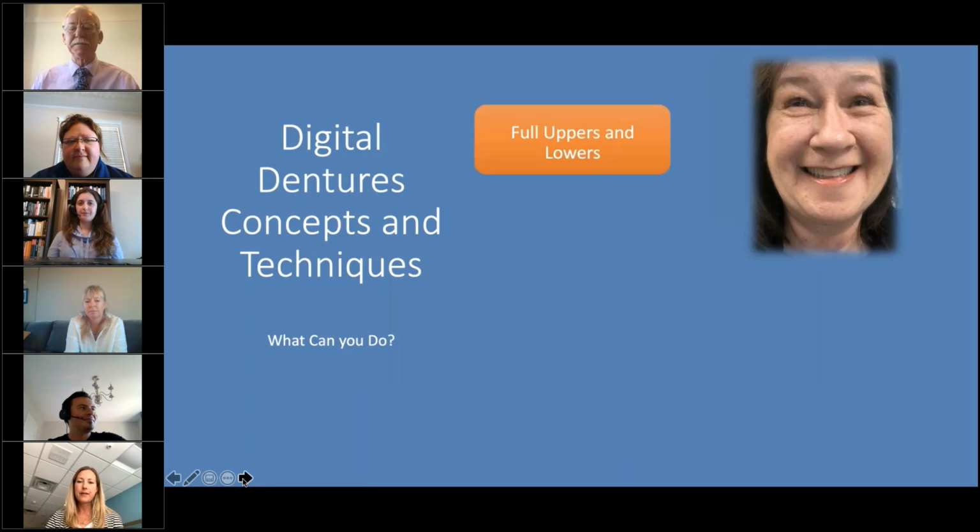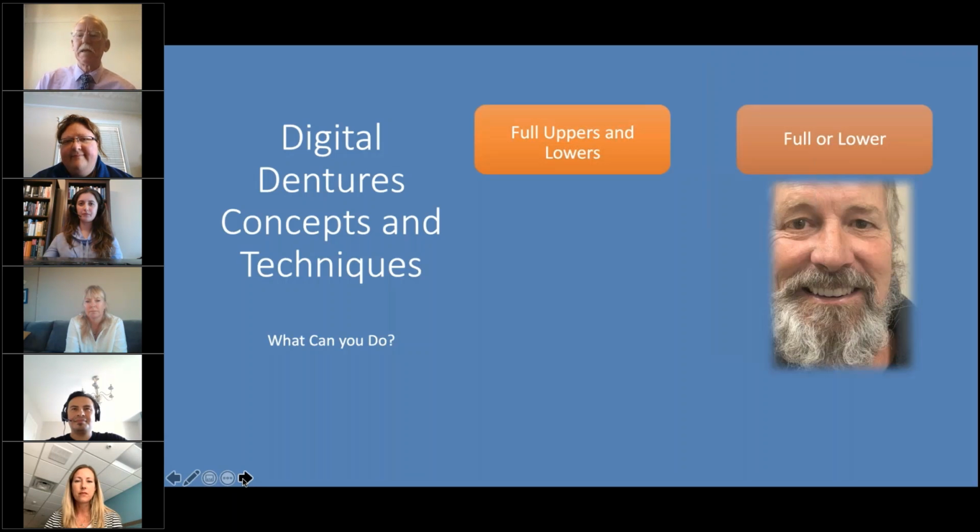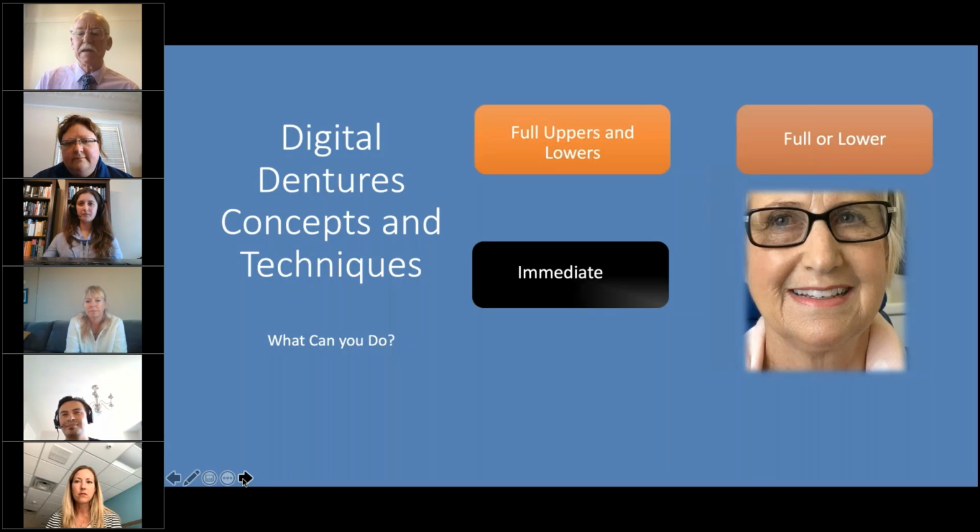So what can you do digitally? Way back in 2011, when I started looking at it, it was only about 2012 and 2013 that all you could do was full upper and lower dentures. There'll be a webinar on how to do that. Full upper or lower dentures, opposing. It's only in the last couple of years that you're really able to do an upper or lower denture to opposing teeth. Immediate dentures. This is an immediate denture done from a Trios scan.